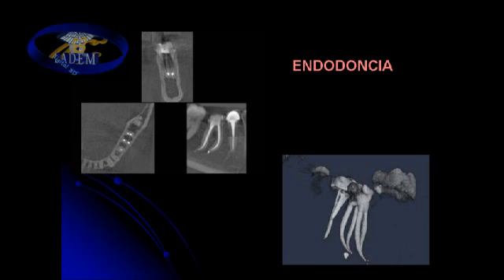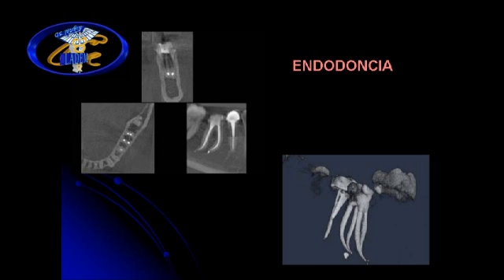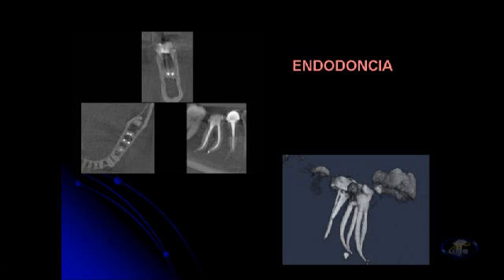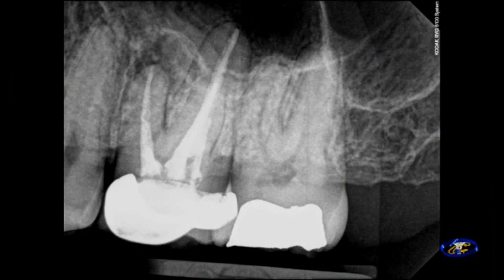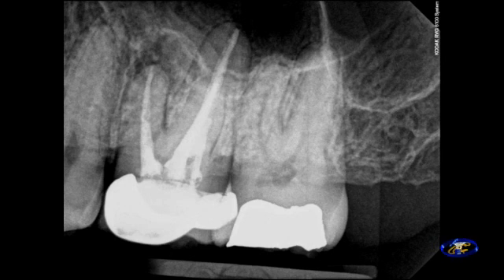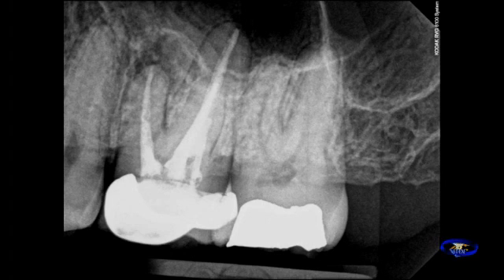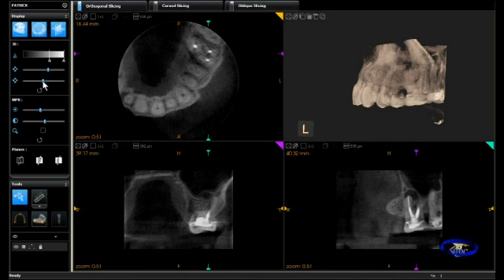This image was acquired with the Kodak RVG 6100 sensor. It's an image taken of an upper first molar that has had endodontic therapy and demonstrates an unresolved lesion at the end of the mesial buccal root. Conventional 2D radiography has limitations when it comes to endodontic therapy, especially in the maxillary posterior region.